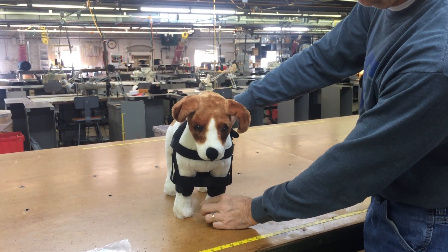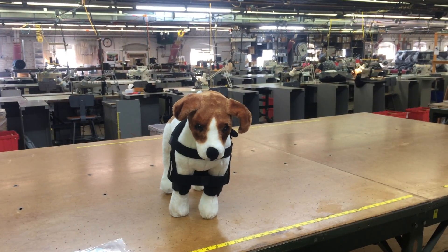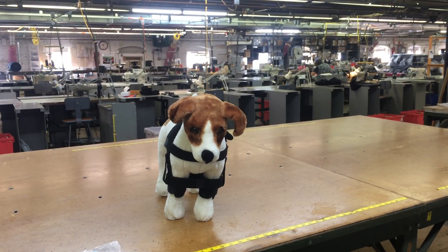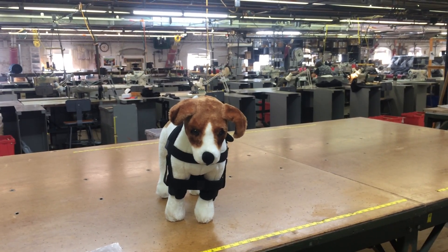Thoroughly inspect the dog at least once a day for any signs of irritation due to use of the product. If irritation is noted, immediately discontinue use and contact Dog Legs for assistance.